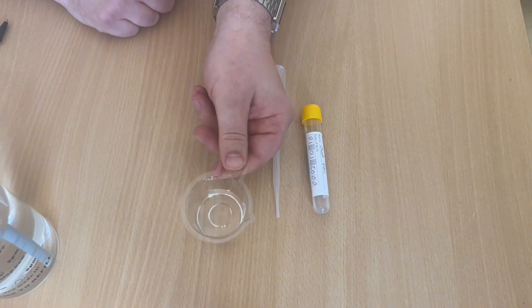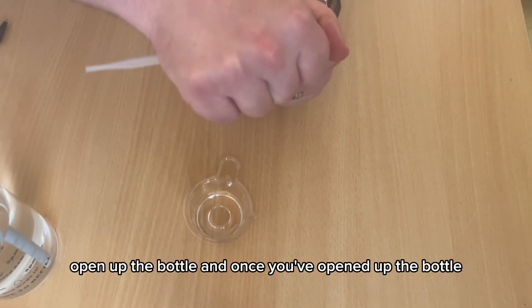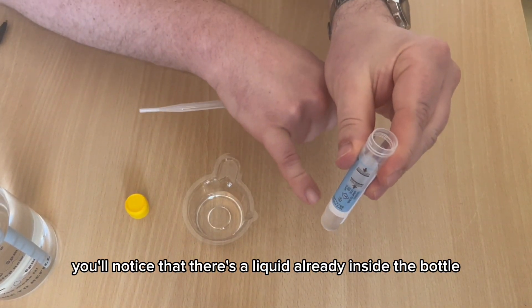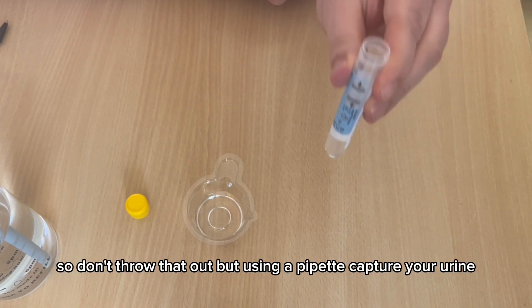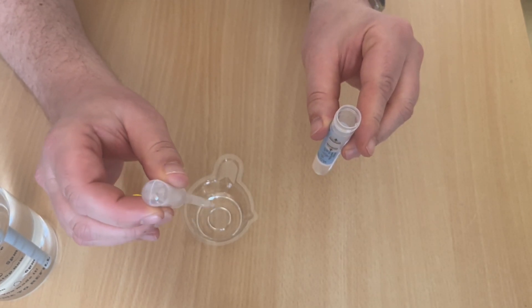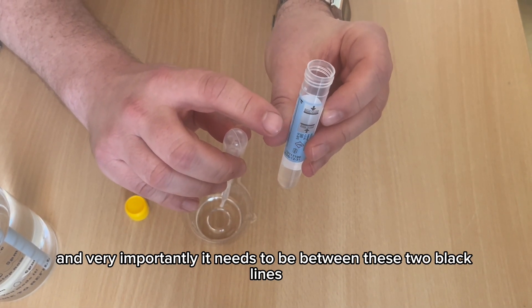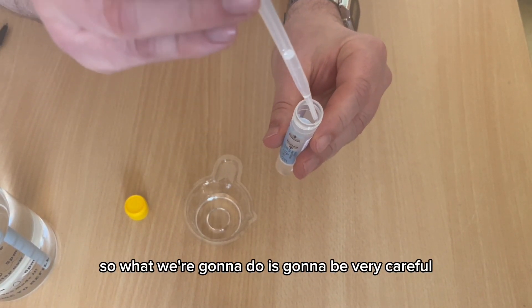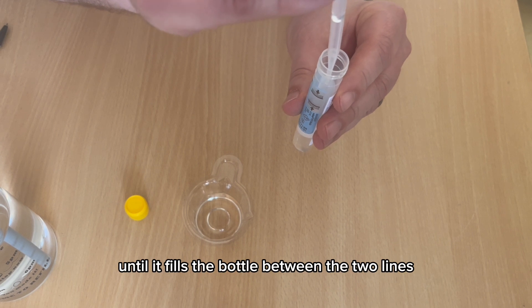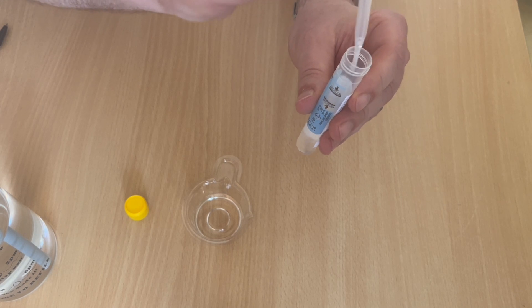Once you've done that, rest the cup on a flat surface and get your pipette and testing bottle. Open up the bottle — you'll notice there is a liquid already inside. That's meant to be there, so don't throw it out. Using your pipette, capture your urine, and very importantly, the level needs to be between the two black lines on the bottle.